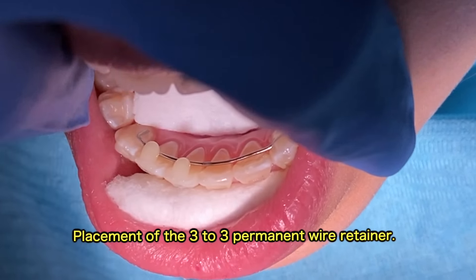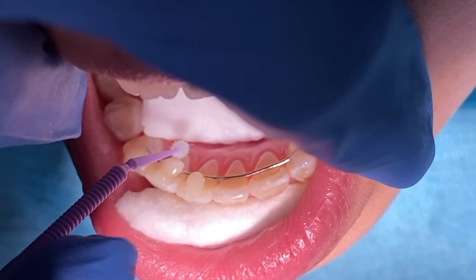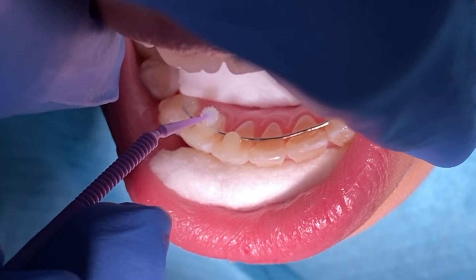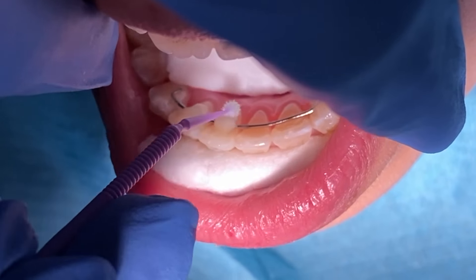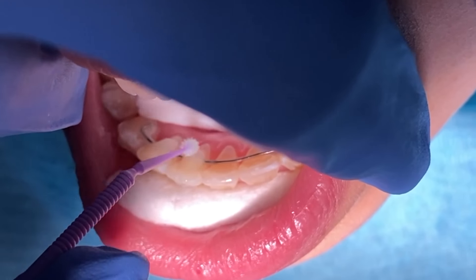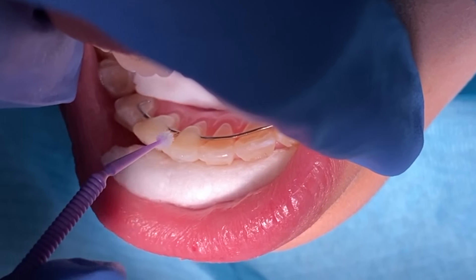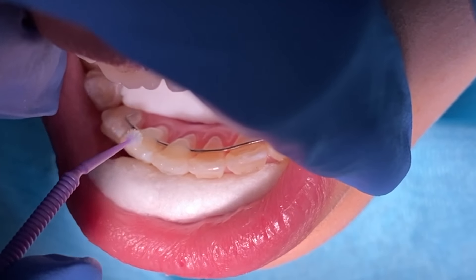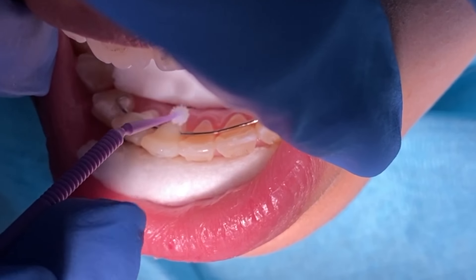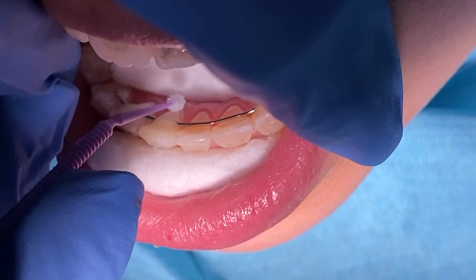We place a lower three-to-three bonded retainer on the bottom because your teeth on the bottom are more susceptible to shifting a lot quicker, and you're also not able to knock it off. But if you plan to not have that three-to-three bonded, then you need to make sure that you wear that clear retainer or the Hawley retainer 24/7, because you're at a high risk for your teeth to relapse in at least the first six months of your post-treatment.